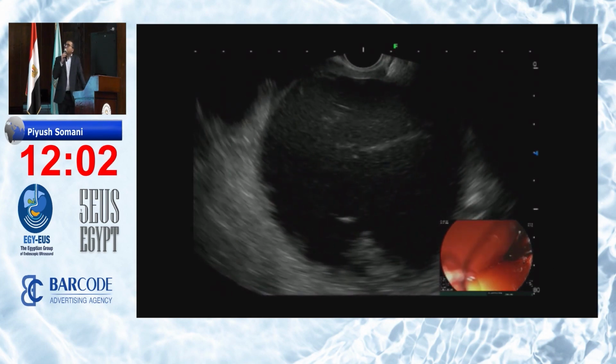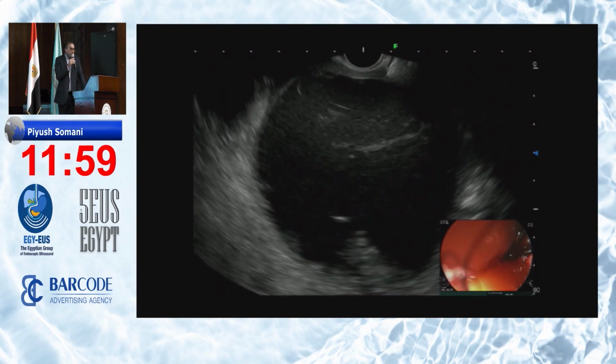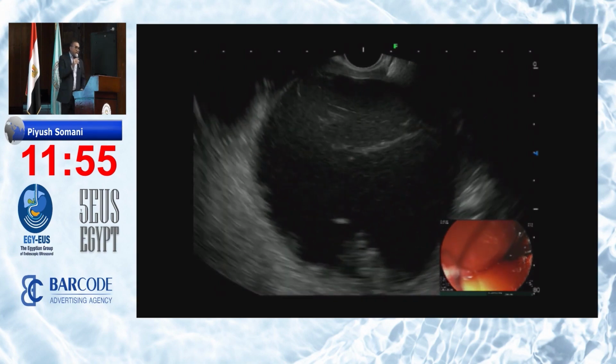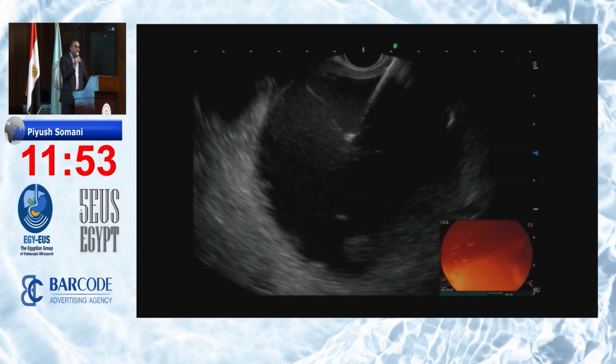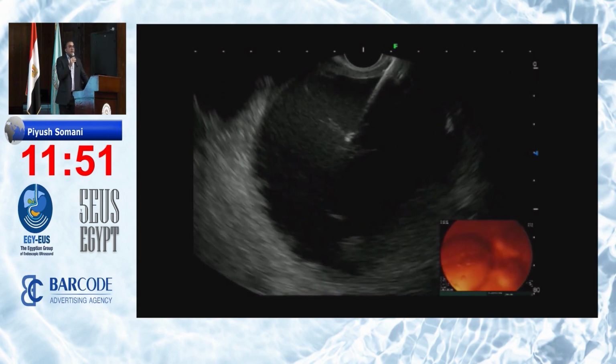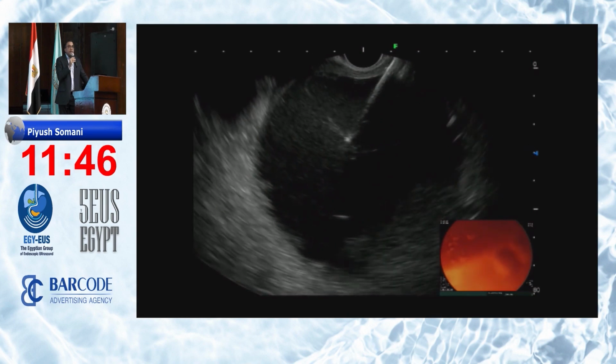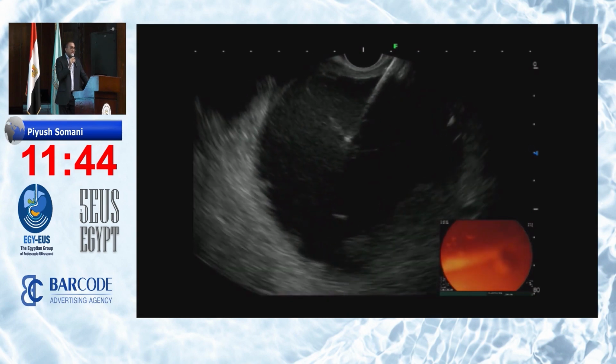Now coming to deployment of Axios stent, the lumen apposing stent. So you can see the endoscopic image and you can see a cyst there. So we are pressing the distal flange of the Axios stent across the wall. It goes through the AutoCut settings. There will be deployment of the distal flange. So as you know, on Axios we have 4 markers which tell us how to move up and down.